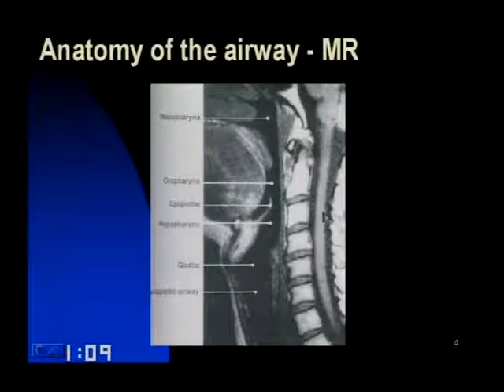Additional imaging techniques for more complete evaluation also consider AP and lateral chest, including the upper airway in full inspiration. Airway fluoroscopy should be considered if radiographs are not helpful in cases of inspiratory stridor. Barium esophagram may be helpful in cases of suspected vascular rings, which are even more elegantly demonstrated by CTA or MRI. So let's take a look at some cases.